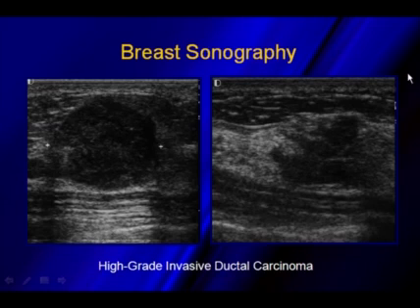And once I actually show you a different projection, this is rotating my transducer 90 degrees, there are obvious malignant features within this lesion. This one image here was a cut taken right through this portion of the lesion. But what we're seeing is a high-grade invasive ductal carcinoma. Just because there's enhanced through transmission does not mean that you're dealing with a cyst. Your high-grade cancers have as much enhanced through transmission as a cyst does. So yes, shadowing is something worrisome for malignancy, but just because you see enhancement, that is not reassuring that you're dealing with a benign lesion.